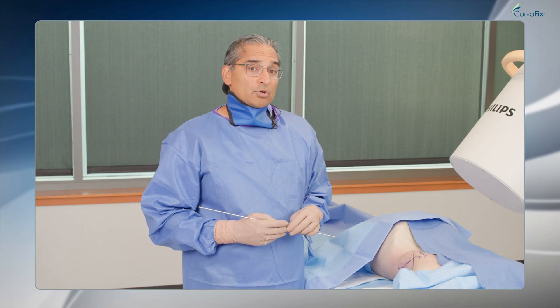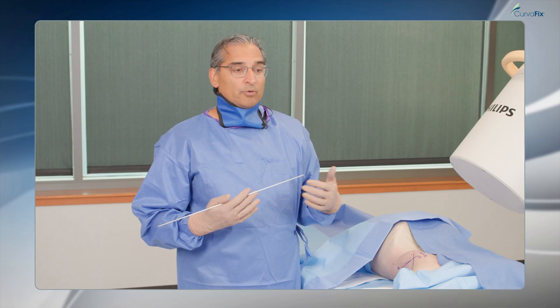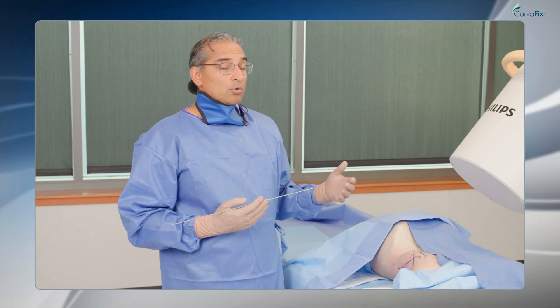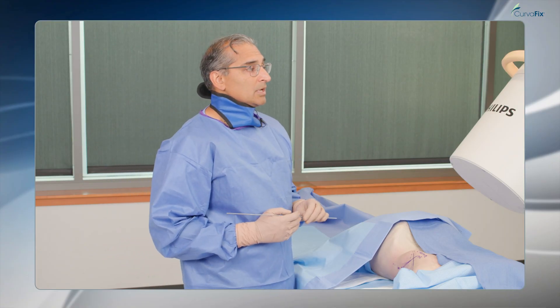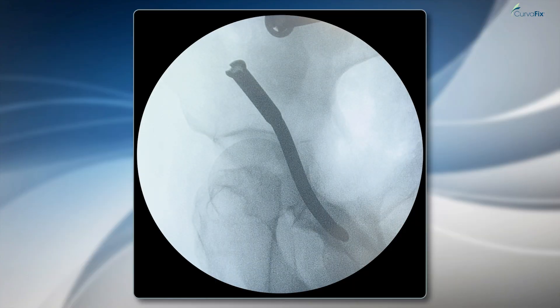When doing a posterior column screw antegrade, the key is to focus on your imaging. The two workhorse images for me are a rollback Judet — on which you can see the posterior column and the outline of the acetabulum — and then the obturator oblique view. We'll start with the starting point before going to that second view.